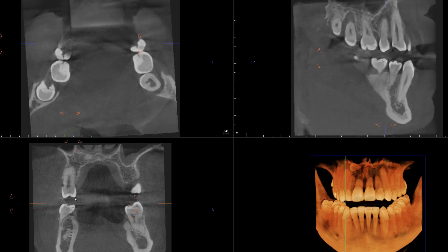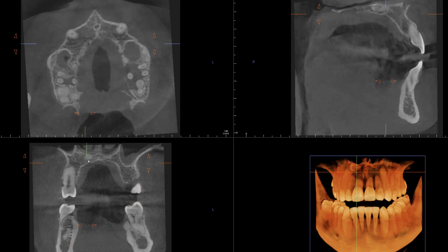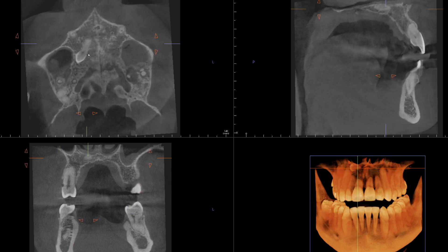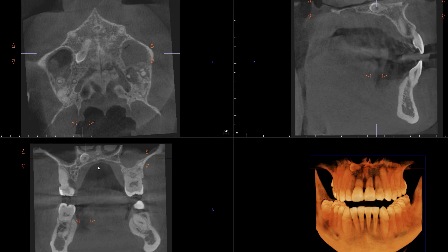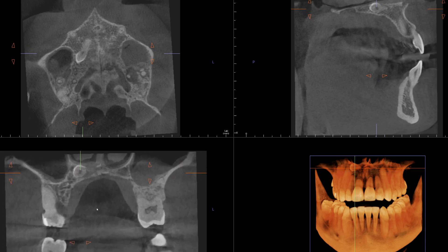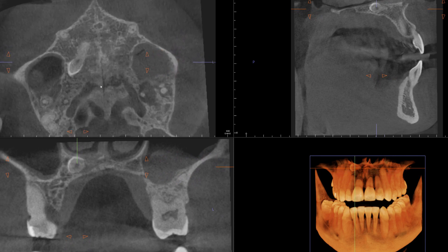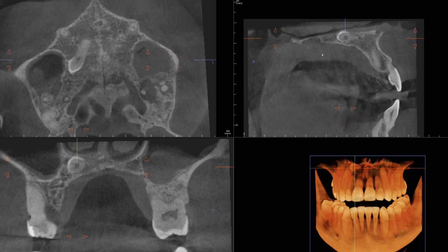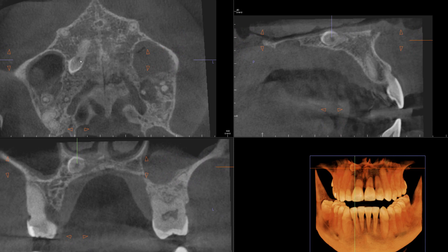I'm going to grab my crosshair and go directly to the area of interest. Right here we see there is a supernumerary that is horizontally impacted, with its crown facing distally or posteriorly, located within the right side of the hard palate.